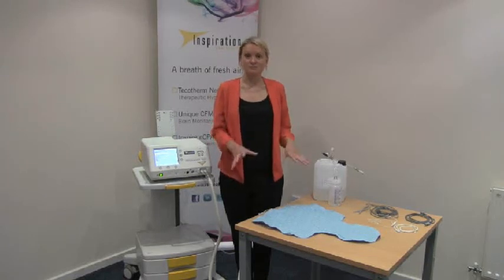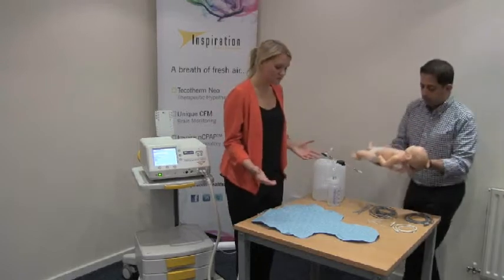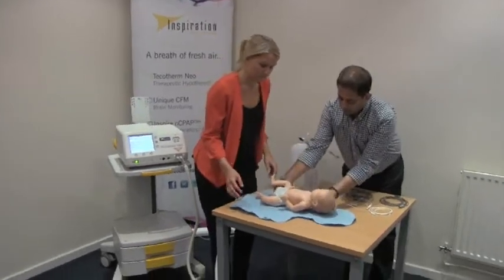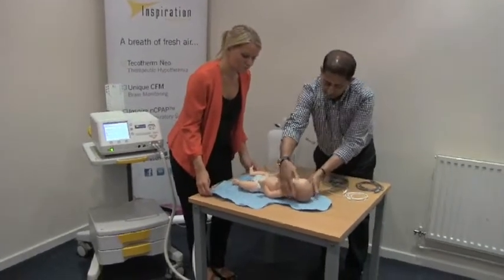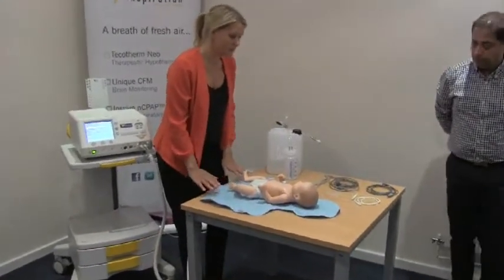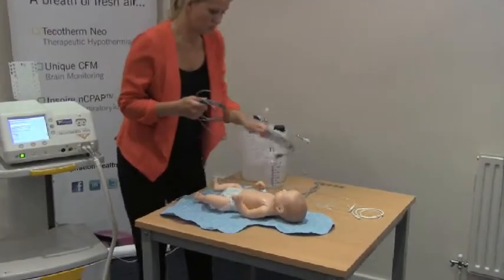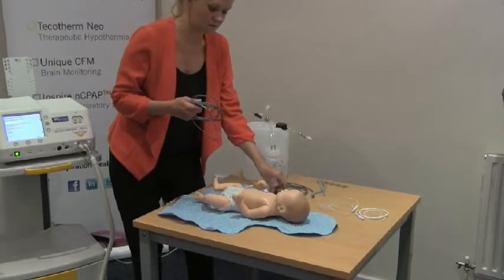Now I'm going to take you through preparation for treatment. Our baby is being transferred from another unit. We place the baby onto the mattress. Now we need to connect up our rectal and skin probes to the system.